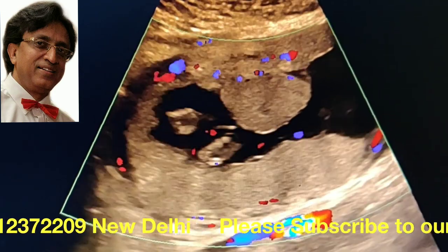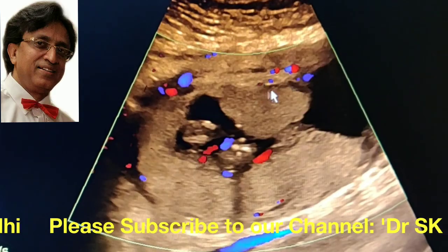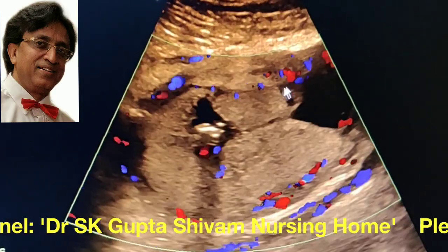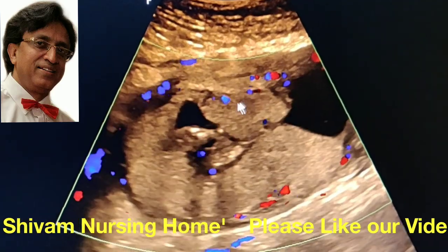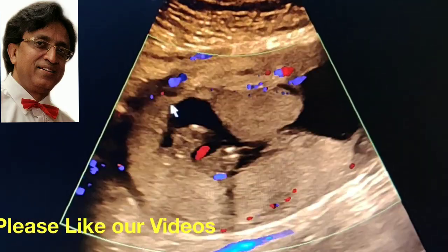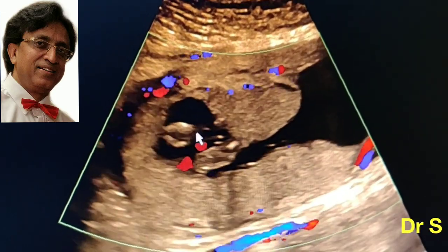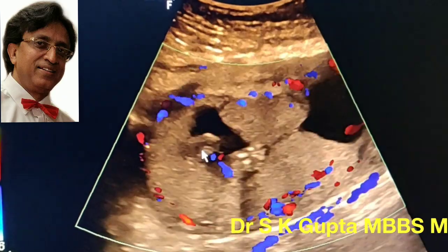This is the color scan of the same patient. You can see the maternal blood vessels behind the placenta in the retroplacental space, and similarly over here also. You can see that this succunturiate lobe of the placenta is connected to the main placenta by small placental tissue or maybe membranes, and it does not have a separate blood supply.